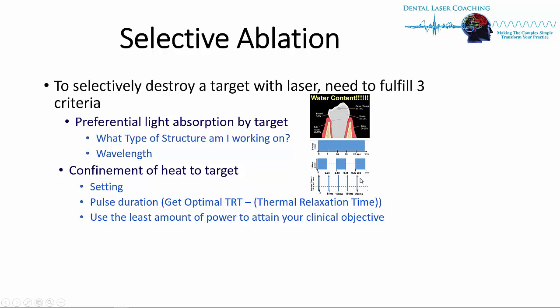And so basically, if we can have it on for a millionth of a second and then off most of the time, we won't have that thermal edema or trauma. These lasers are a little bit more expensive, but they allow for more TRT, thermal relaxation time. So we want to use the least amount of power to attain our clinical objective. Even though this may be a high peak power, its average power is quite low. And it allows the tissue to relax, and the patient will heal quicker and have a much better experience. So from a technique perspective, to get all this done, we need to master distance, angle, and speed of movement.